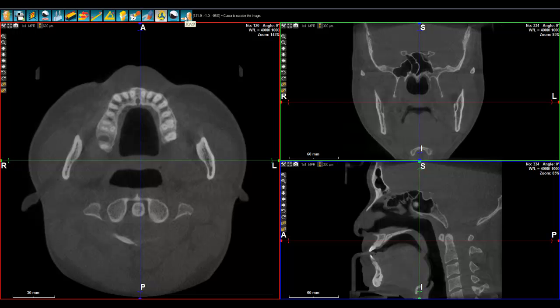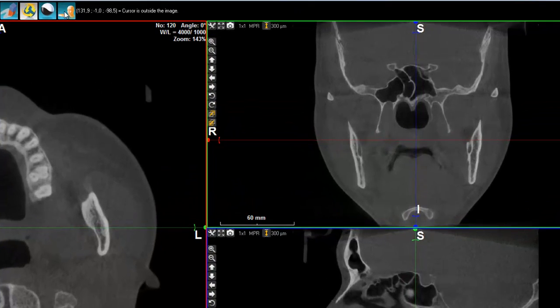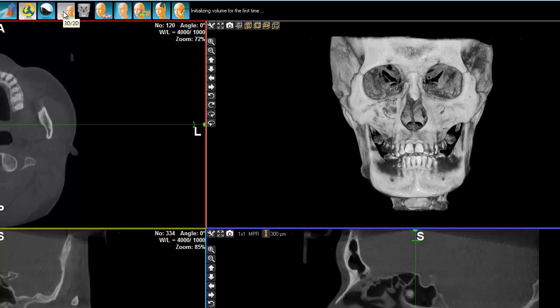There is one application we can see: the application of Sinus Lift. For a Sinus Lift, you need to have a certain quantity of biomaterial, and it's always nice to know in advance what is going to be the volume of this biomaterial that you are going to be needing.